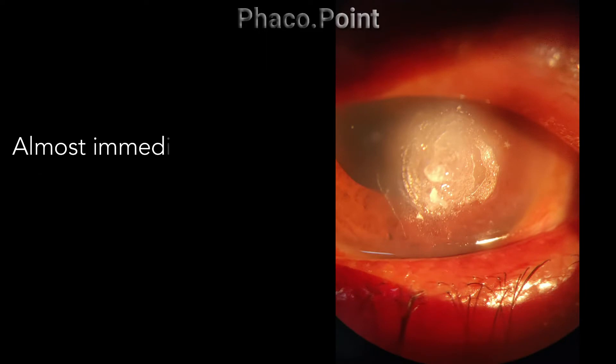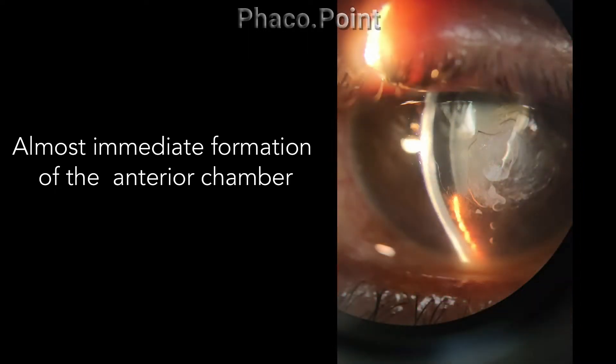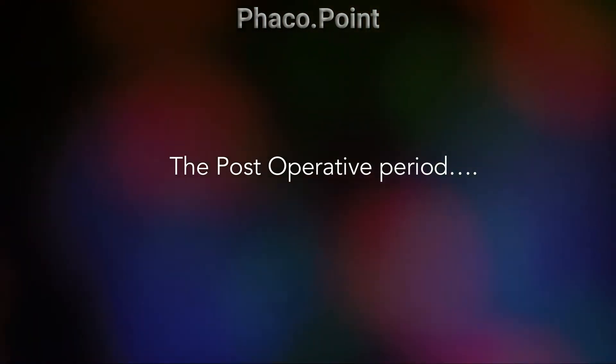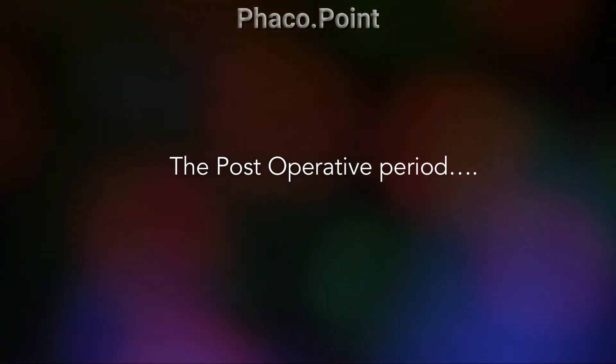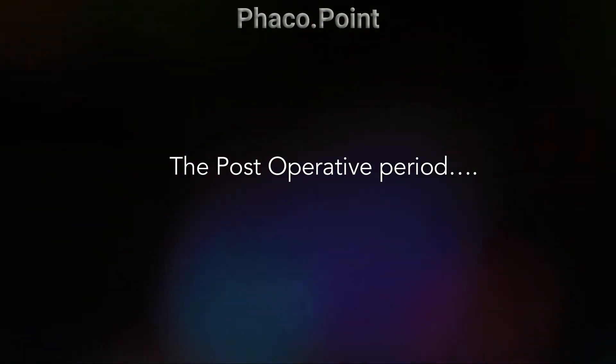Having achieved this perfect seal, you will note how almost instantaneously the anterior chamber starts to form. Hence, there is no need to reform the anterior chamber with air or saline in the intraoperative period. I'd like to now share the post-operative images demonstrating the manner and speed in which the anterior chamber forms in the post-operative period.